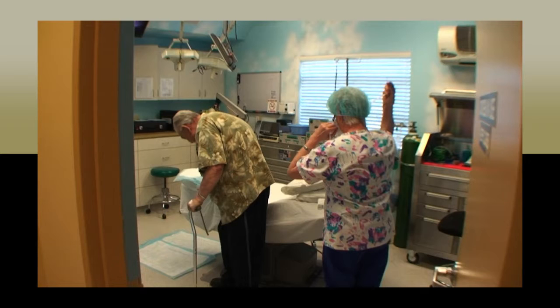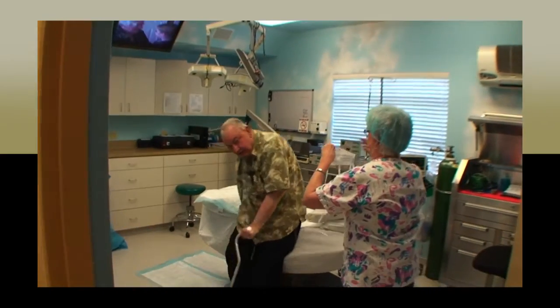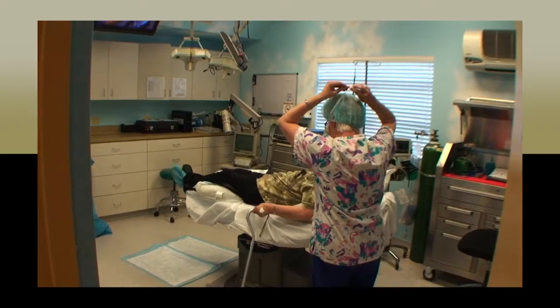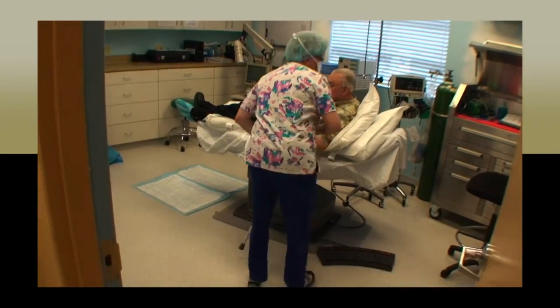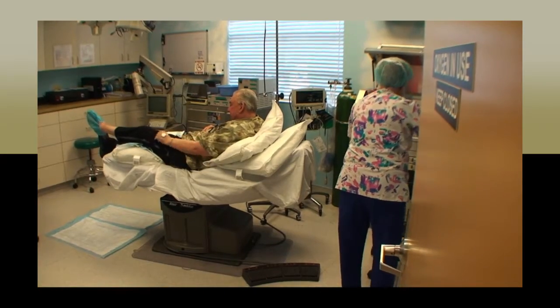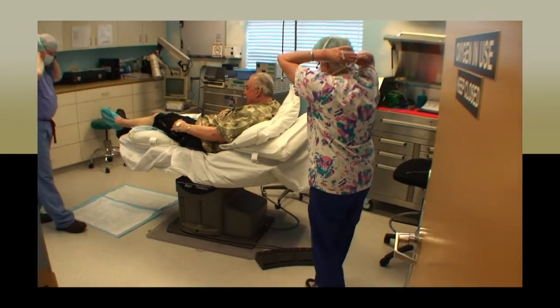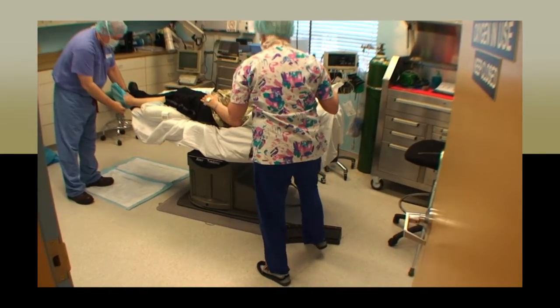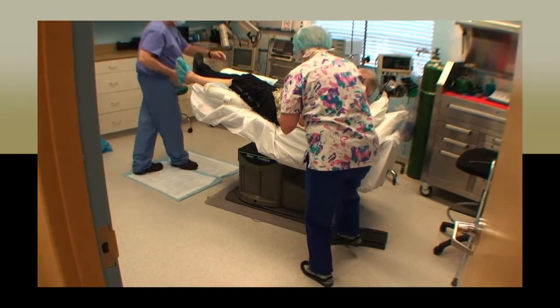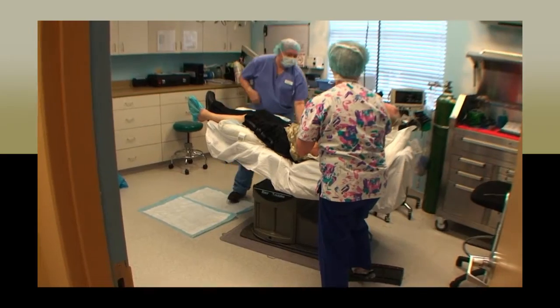Ask the patient to sit in the middle of the table, then to lay back so their feet are at the bottom of the table, just before they're about to hang off the end. Once properly positioned, assessments should be done to ensure all bony prominences are padded and the body is in good alignment. Respiratory, circulatory, musculoskeletal, neurological, and integumentary system checks should be performed and reviewed for any signs of compromise.